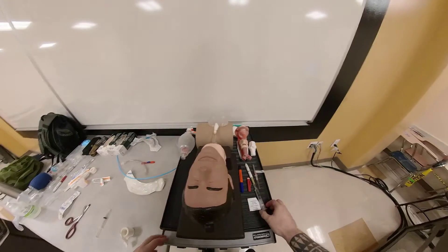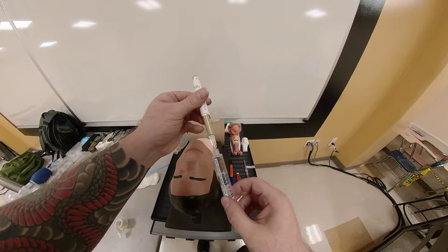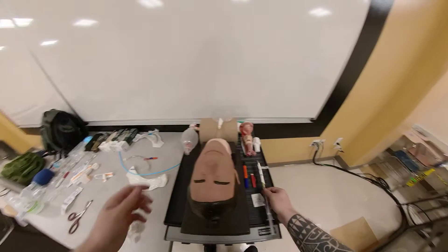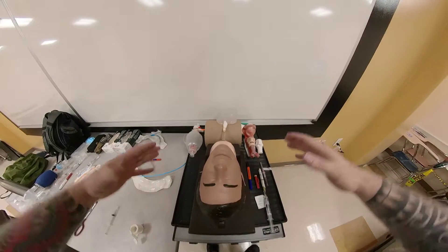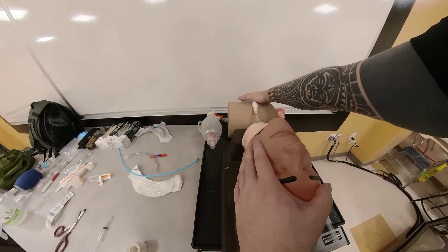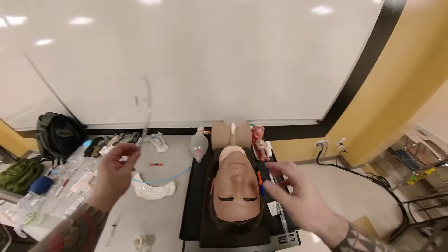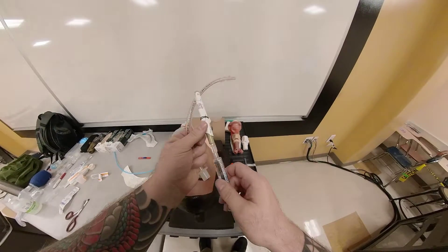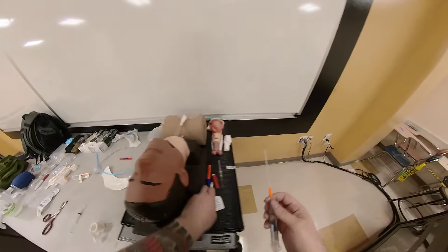Know that needle cricothyrotomy is not as efficacious as surgical cricothyrotomy. The reason is that we're going to place a 14-gauge catheter, and the lumen is very narrow even though it's 14-gauge. Truly speaking, you're not going to be able to ventilate the patient. All you are going to be able to do is provide some passive oxygenation, and then after a while, when the chest gets distended, you may need to disconnect your device and press on their chest to get rid of that buildup air. For surgical cric, we're using an ET tube 6.0 — a way bigger lumen than any 14-gauge catheter — so this is not as effective.